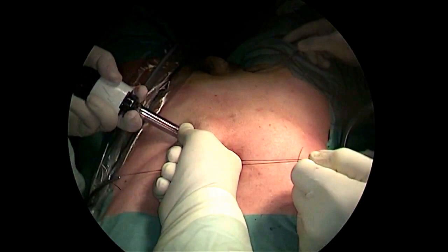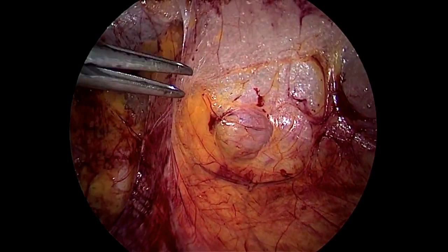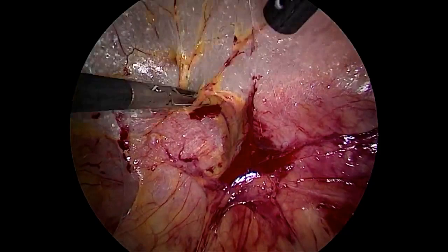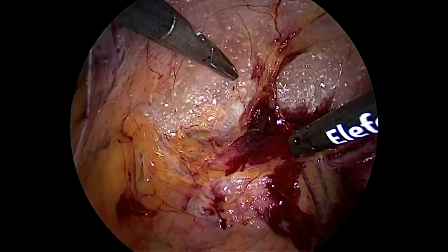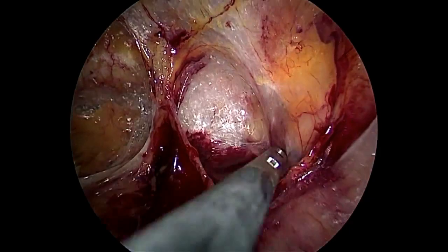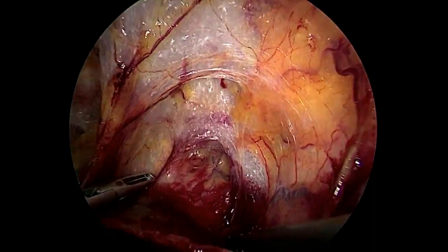Obviously, this is the extraperitoneal approach, as you can see. This is the retropubic space, completely similar to the access that we do for radical prostatectomy. And I try to gain the space in order to visualize the pubis at this level. Okay, it's clear now, and bright. More, can you put it here? Okay, here. Sorry.